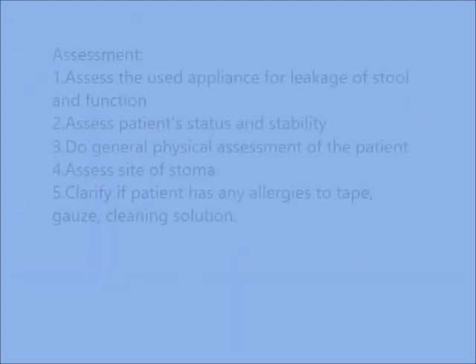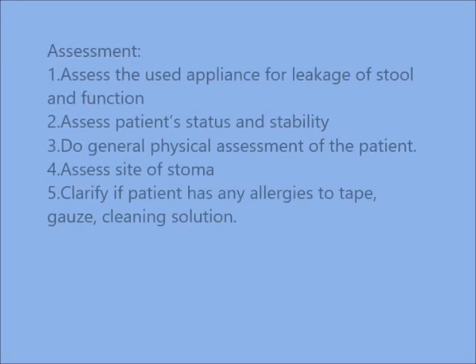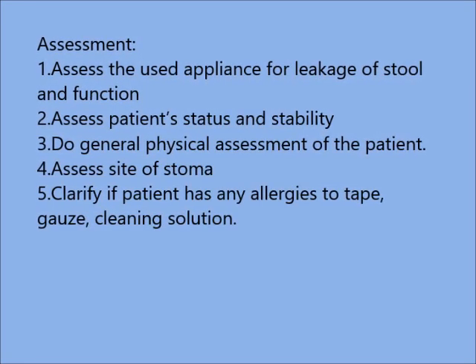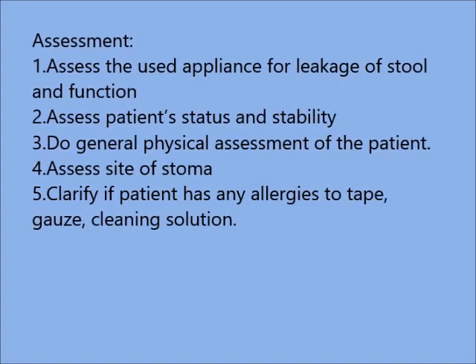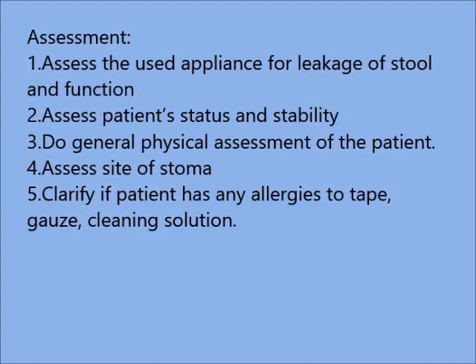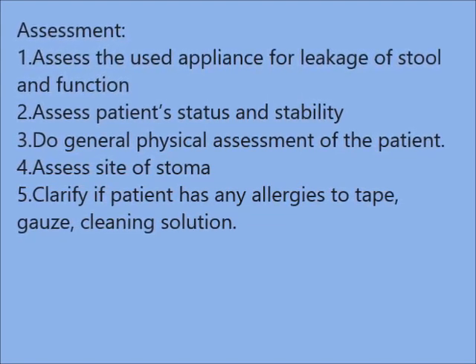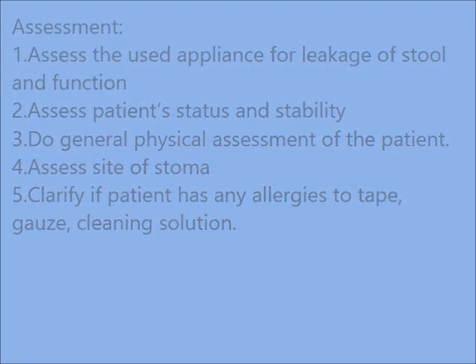Prior to starting the procedure, ensure to assess the used appliance for leakage of stool and function, assess the patient's status and stability, do a general physical assessment of the patient, assess the site of the stoma, and clarify if the patient has any allergies to tape, gauze, or any cleaning solution that will be used.